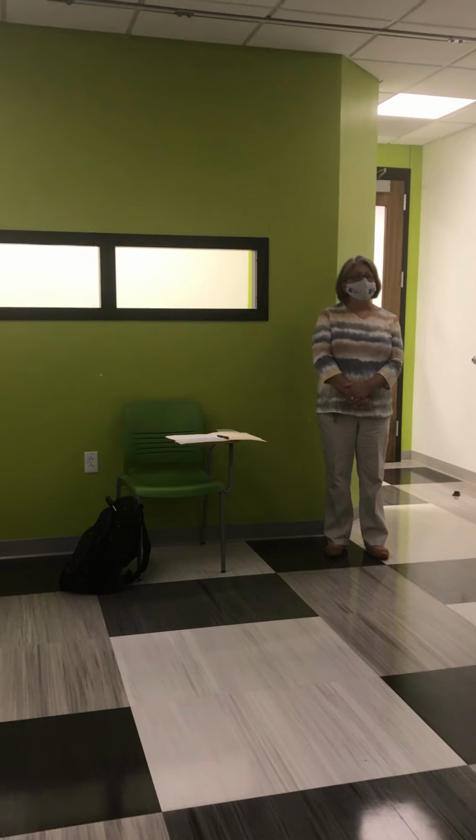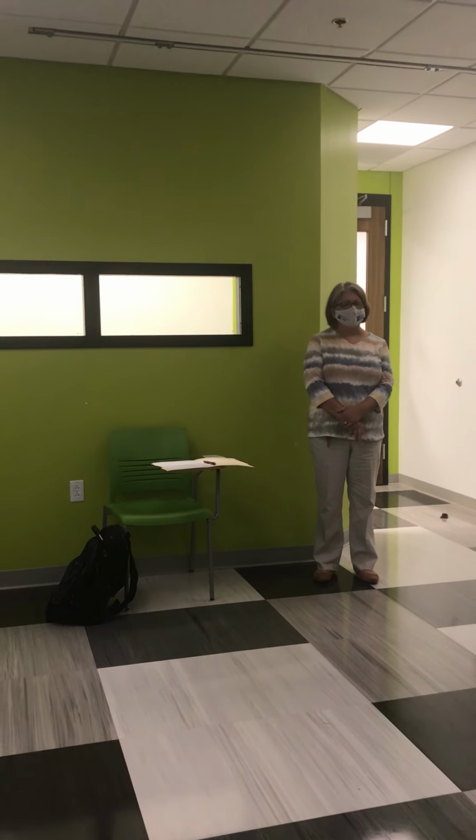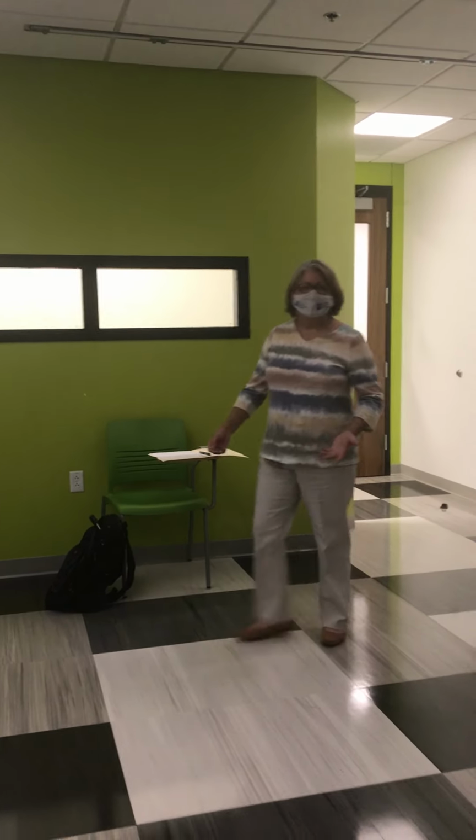Take in a deep breath. Blow it all the way out. Hold it out. Don't breathe. Exposure. You may breathe and relax. So you notice that one of the differences on the abdomen exam from the chest exam is that we're taking this exposure on expiration. Folks, there's always a why behind what we do.